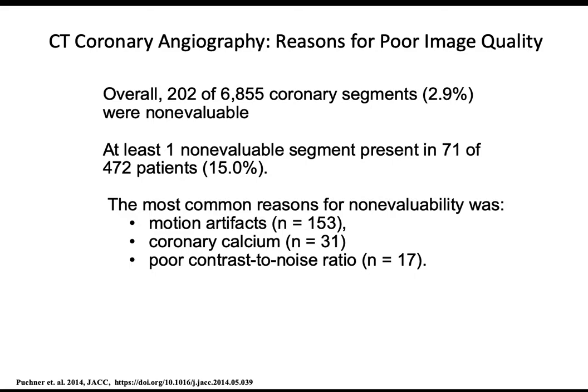The other thing is that the calcium could be nearby, and because it has a point spread function of its signal, it can kind of mask or bleed into the vessel, and then you're not sure if the brightness in the vessel is because of the iodine or because of the calcium signal that is bleeding through. And so instead of saying, that's totally open or that's totally closed, you may just say, I can't evaluate. Lastly, if you're big and the x-rays get eaten up by non-coronary tissues and your detectability goes down, or if the injection was not robust enough, in terms of enough iodine making it to your heart, that might decrease your confidence in saying that that vessel is actually open.